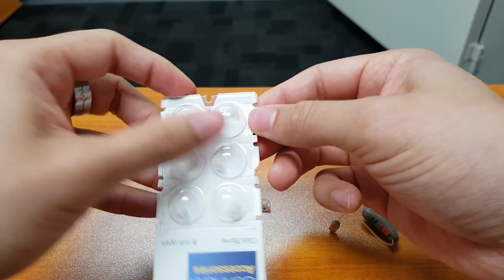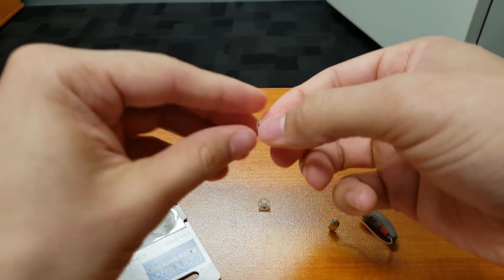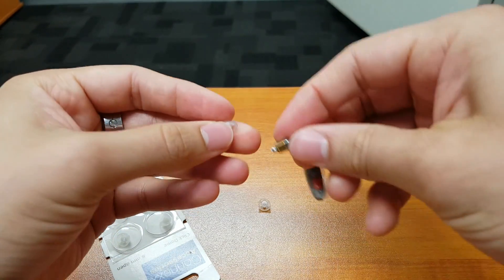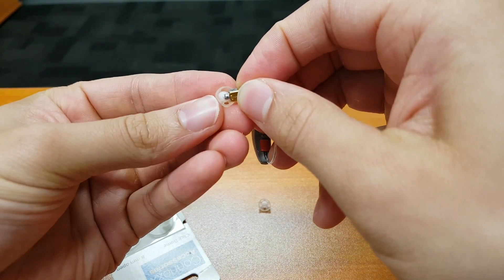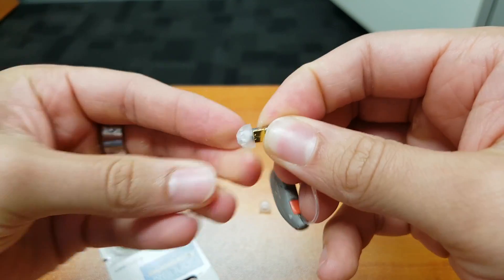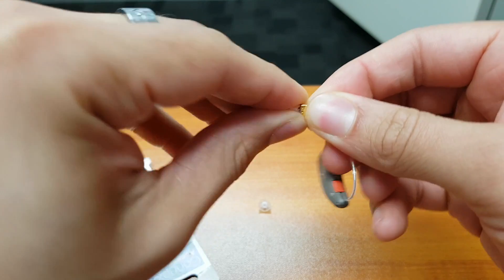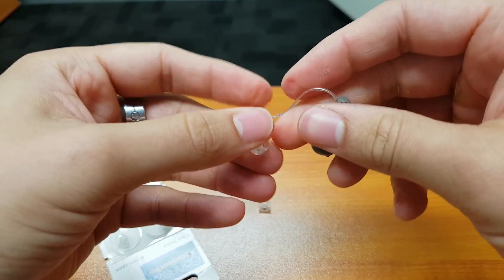And what we'll do is grab a new dome and we'll just line that up like so and click that into place. We give that a firm pull, that's not going anywhere, so it's nice and secure.